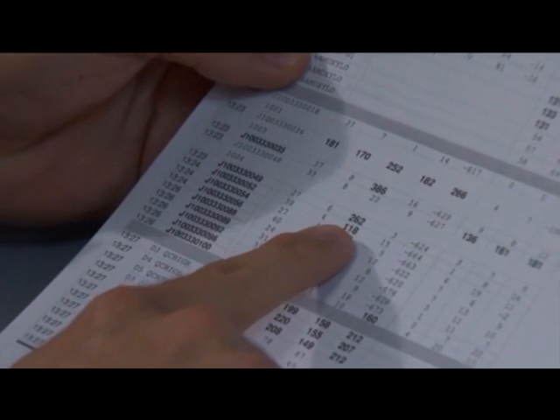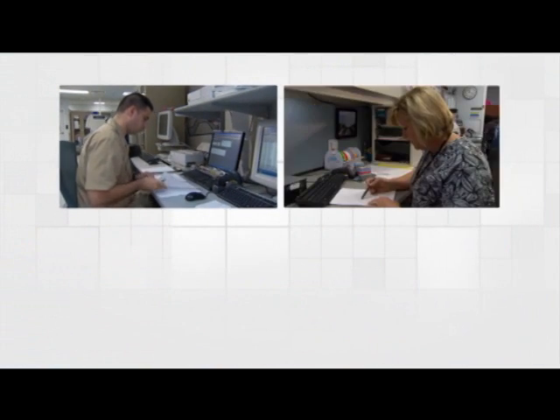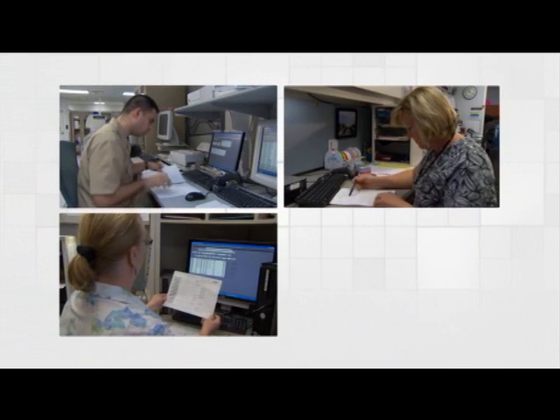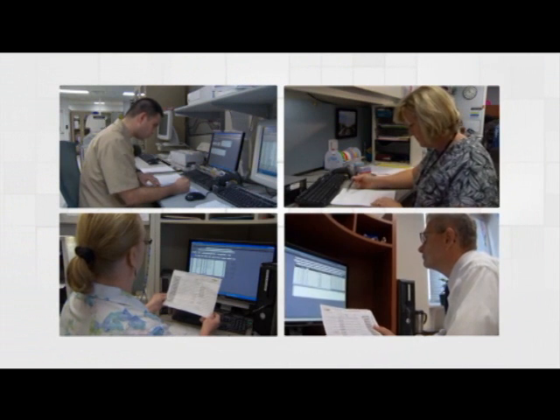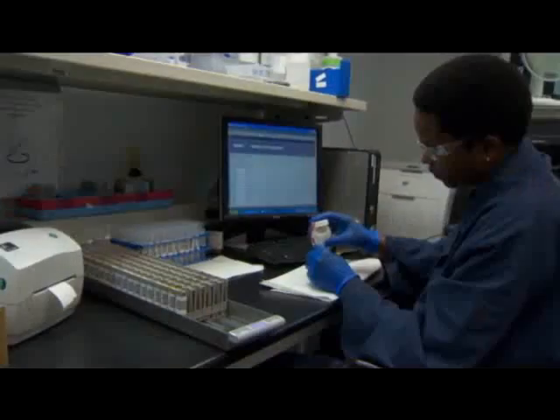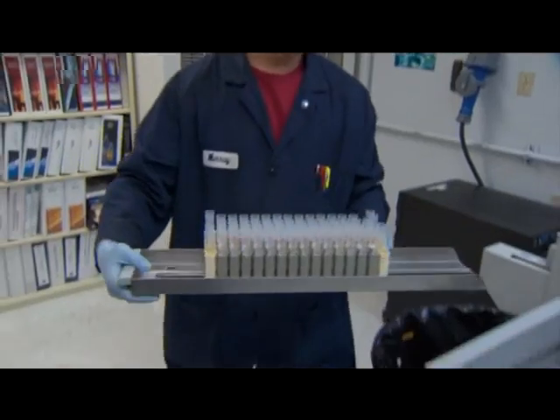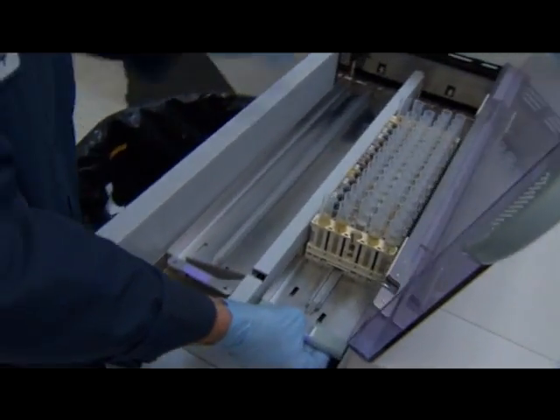If a drug is detected on the initial screen test, the results are reviewed by the technician, the quality control personnel, the initial laboratory certifying official, or ILCO, and the final laboratory certifying official, or FLCO. If all 4 of these individuals verify the findings, another aliquot is poured from the original specimen bottle and tested again by immunoassay. This second immunoassay test is called the rescreen.